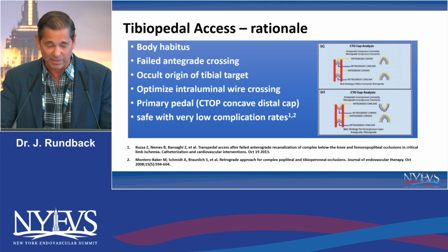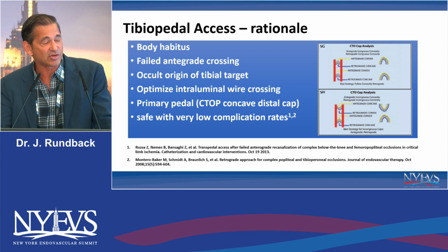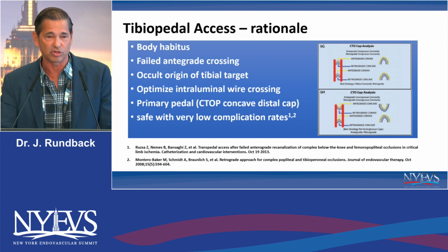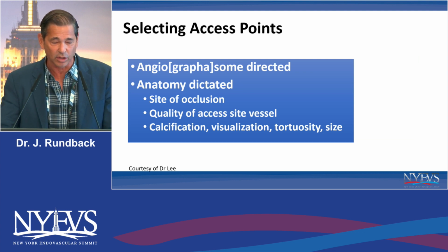And it's quite safe. I mean, there's some data here that you can reference, but the concern that we had that accessing a pedal vessel has long-term risk or complications or would jeopardize the limb turns out not really to be true. And there's a lot of ways to get both internal and external hemostasis and preserve flow through the forefoot and pedal arch.